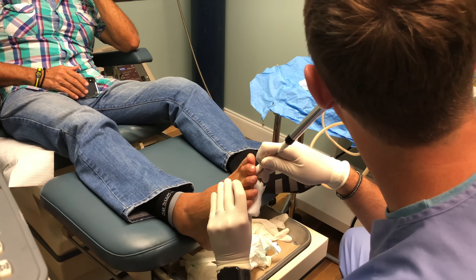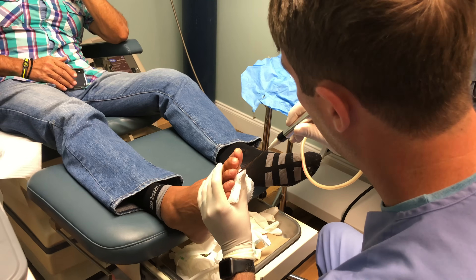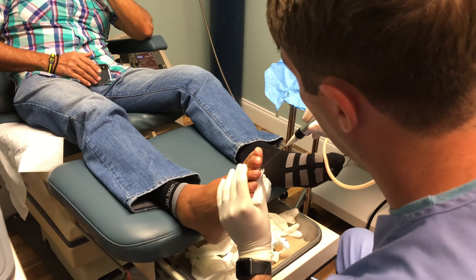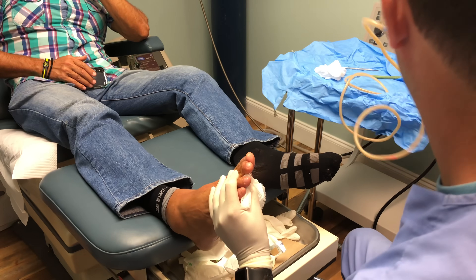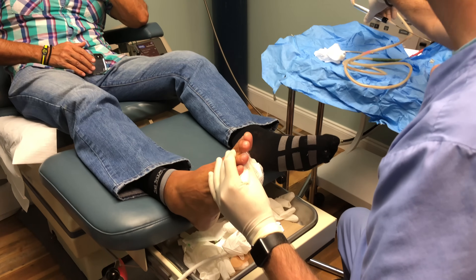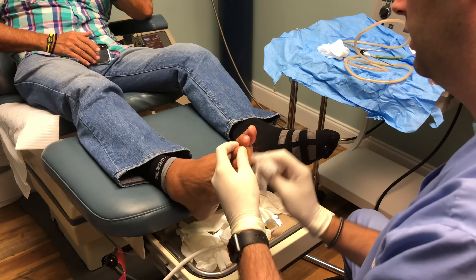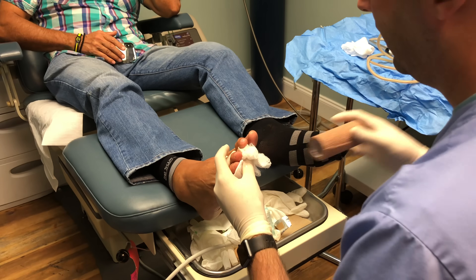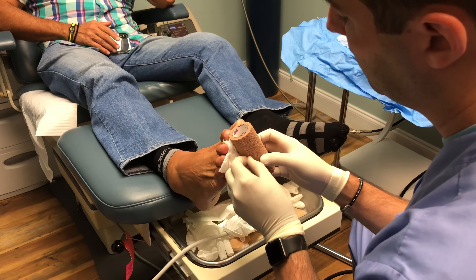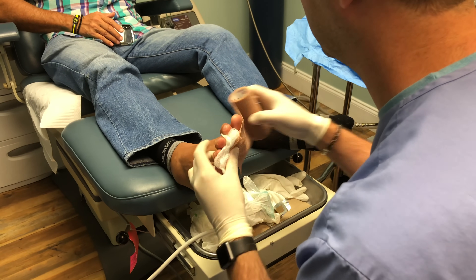All right, almost done. That's it. Once it's done, I kind of wiggle it a little bit because it's frozen inside your foot. And then it will stop. All done. So what I'm going to do is clean this off first, then just put a tight wrap around it for right now. And then I'm going to go draw up the PRP and we'll come back in and do those injections on top. Any issues or problems right now? No. Good.